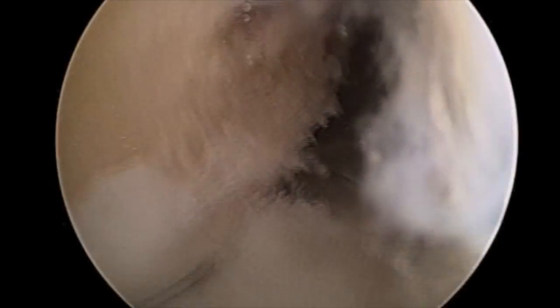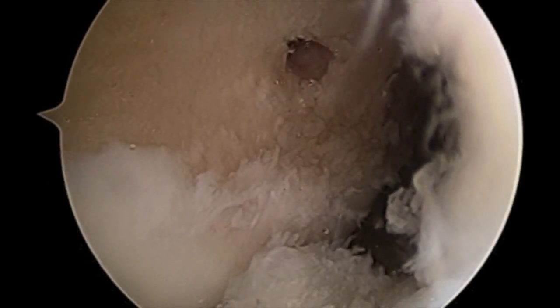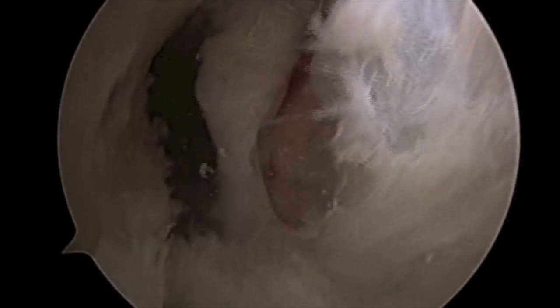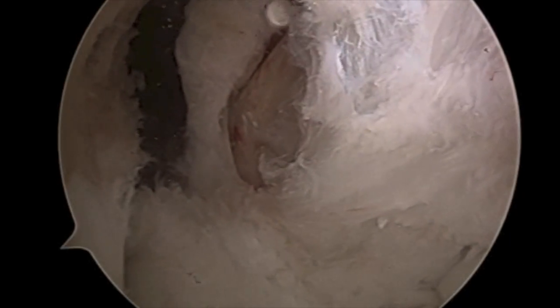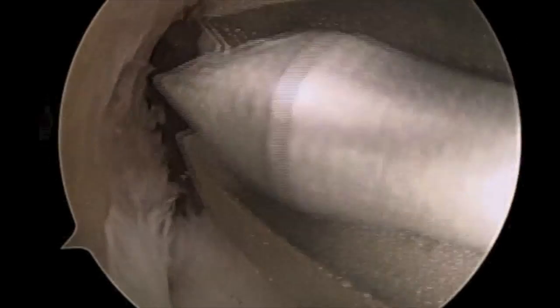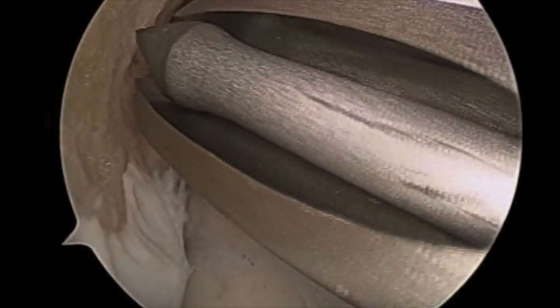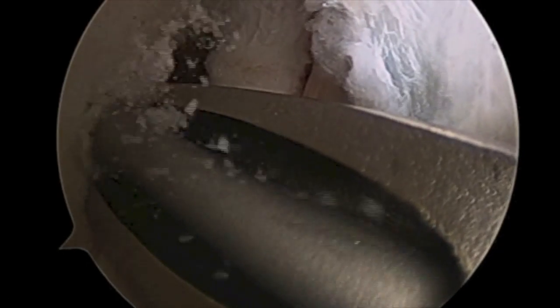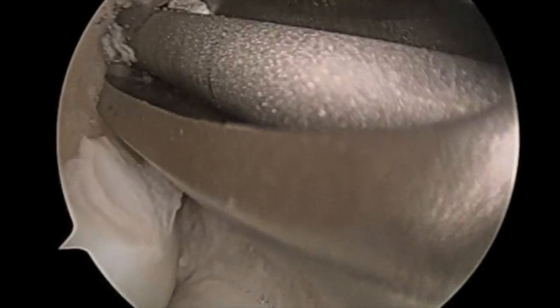The arthroscope is switched to the medial portal to visualize this marking, then switched back to the lateral portal. A curved guide drilling system is introduced through the medial portal, and the previously placed marking via the microfracture awl is utilized to place the flexible guide pin into the appropriate anatomic position.